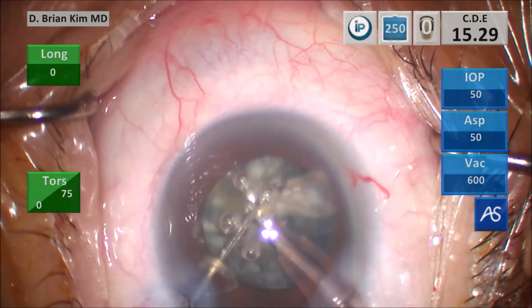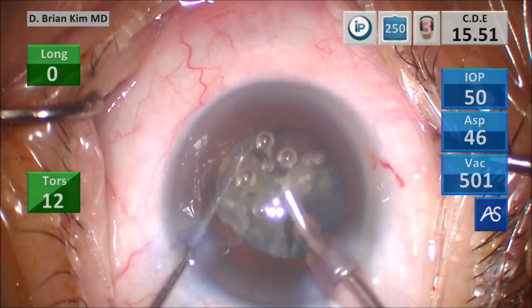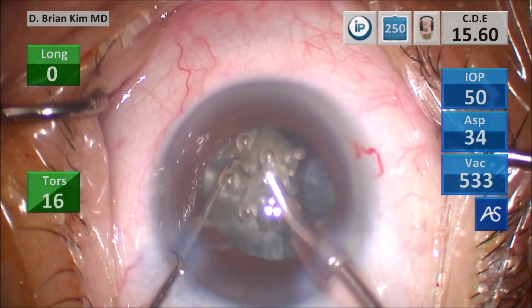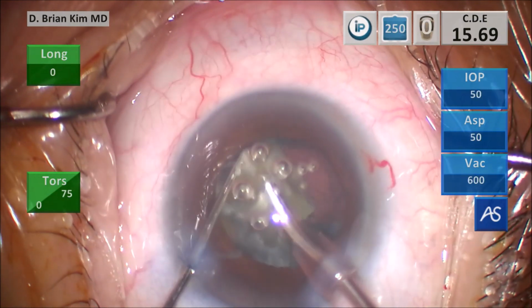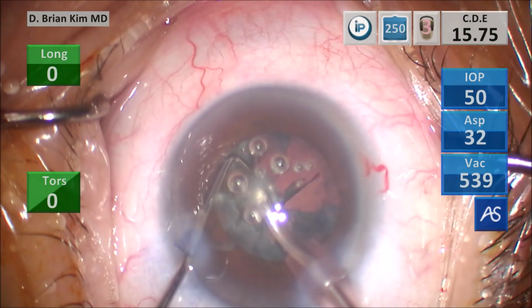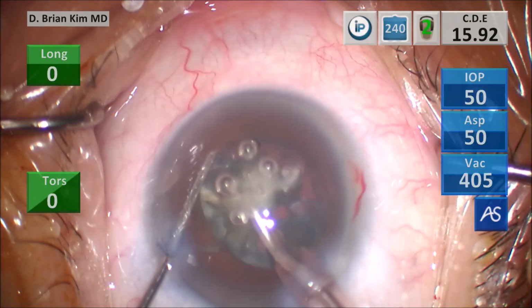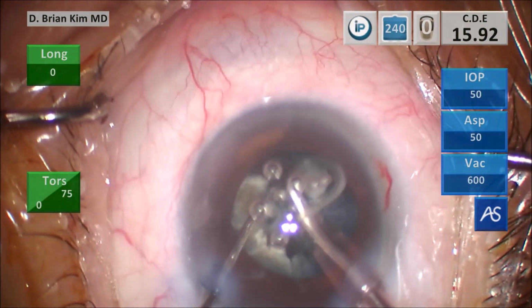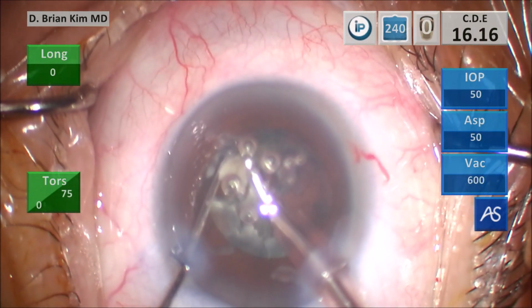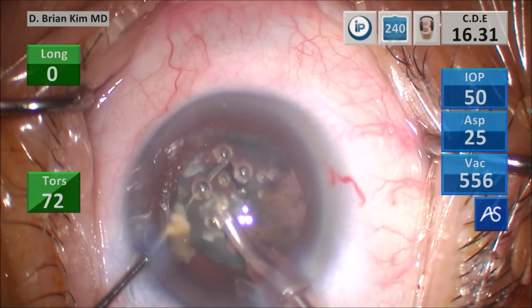Some of you might be doing surgery, and unbeknownst to you, you're removing the dispersive viscoelastic as you're doing the lens disassembly. And if you use a lot of ultrasonic energy, which a lot of people do, they just want to do the easy thing and put their foot on the pedal and just eat up the pieces in 2 seconds. Well, guess what? You're causing a lot of ultrasonic energy to go into the eye. And if you've eaten up that viscoelastic that's protecting the cornea, well, guess what? After surgery, you're going to have a steamy cornea, and you're going to wonder why that happened. And that's because you did not protect the corneal endothelium based upon the way you do surgery.